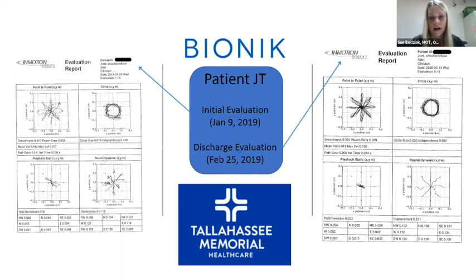So we have an entire hour with a patient, which is really nice. And like I said, there are 2 other therapists that I work with. So we have come up with a little protocol of just doing 30-minute sessions, and we have a little sign up. So we know when our patient's coming, and we'll sign up for the first 30 minutes of the session or the last 30 minutes of the session. I prefer having the first 30 minutes of the session. I really love doing the robotic arm to get their arm warmed up and get them motivated before we do an ADL or do a therapeutic activity.